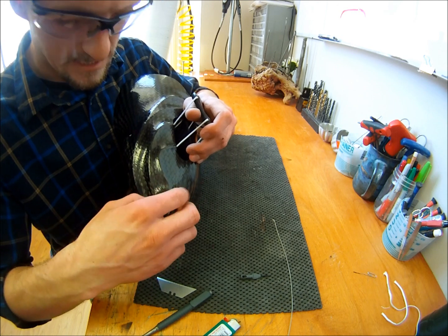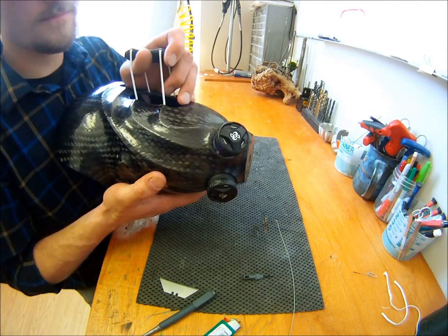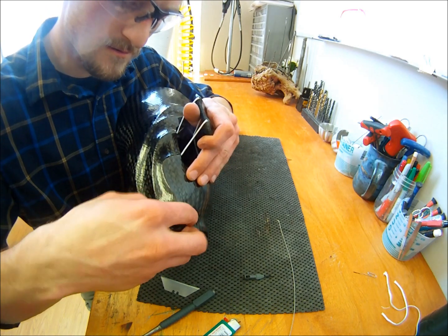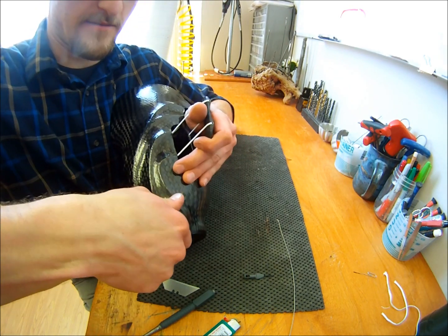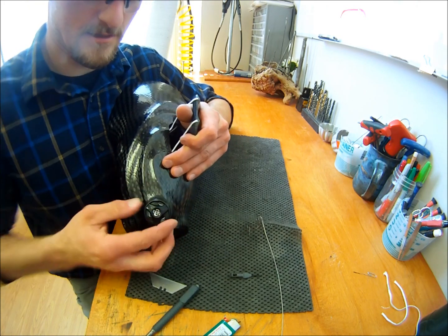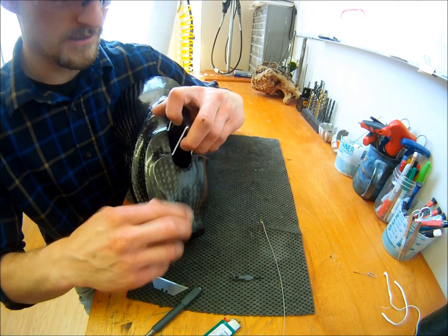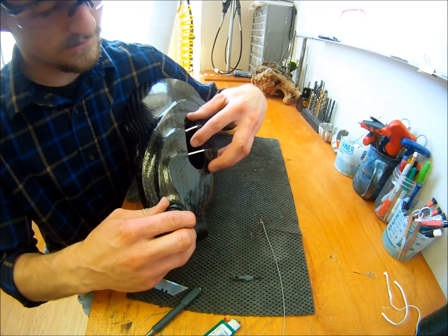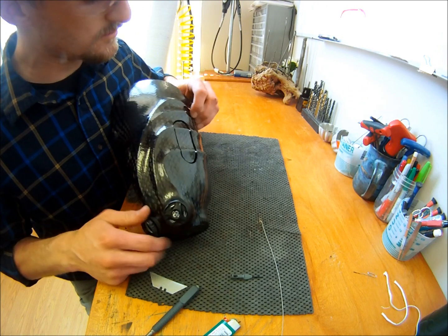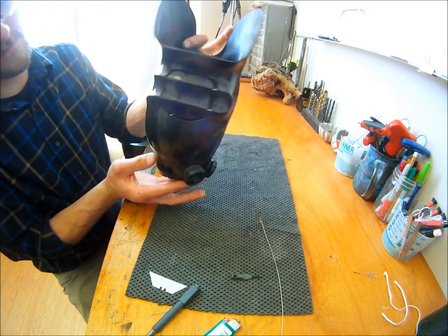Line everything up, line up the tabs, and inspect to see that you're not pinching the cable. I'll just drop that right back in there. And once you click it down all the way, give it a small click counterclockwise, and you'll know it's in place because you can't pull it out. It's locked in. At that point, keeping tension on the system, go ahead and begin winding it up. So there you have it.